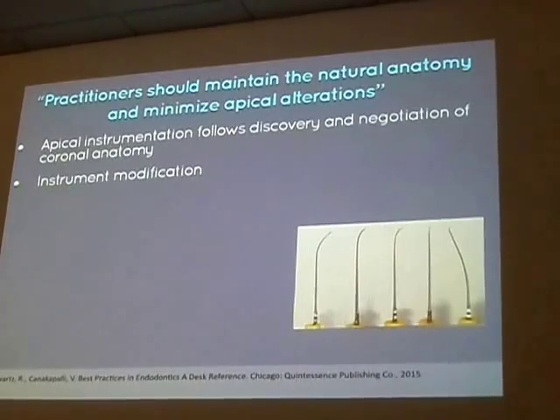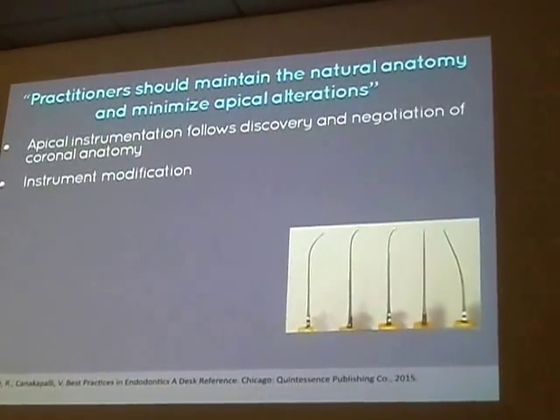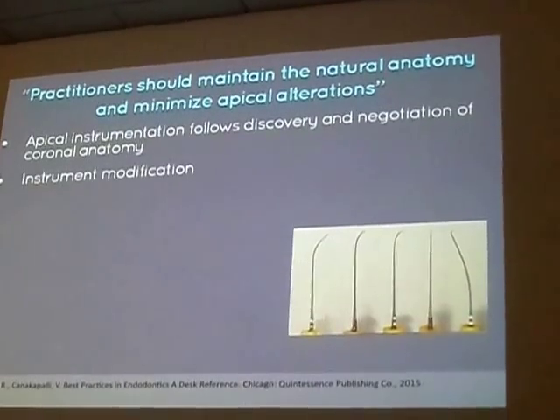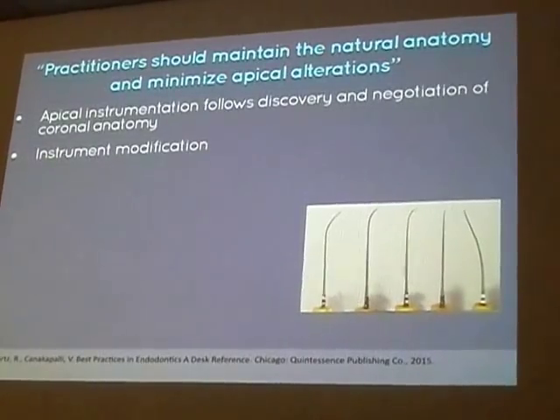Furthermore, instrument modification. So making sure to pre-bend the file before we put it inside of the tooth. And sort of understanding the anatomy of the apex before you even start instrumenting the tooth so that you can properly modify the instrument according to the apical anatomy.